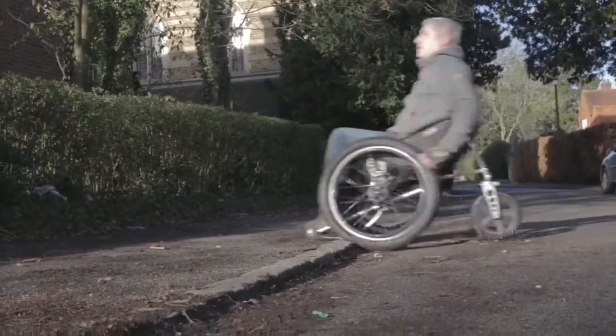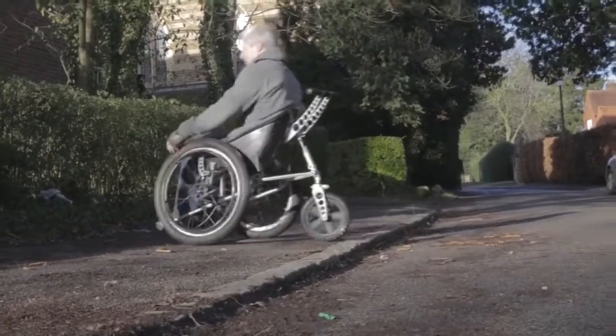Myself, standard curb, 3 or 4 inches, you just tip the chair back so the casters are way off the ground, just charge the curb. If you wanted to go up something slightly higher, 5, 6 and more inches, you can actually turn the chair backwards and back up to the curb. If you tip forward and raise the rear caster, you can roll up the curb that way.